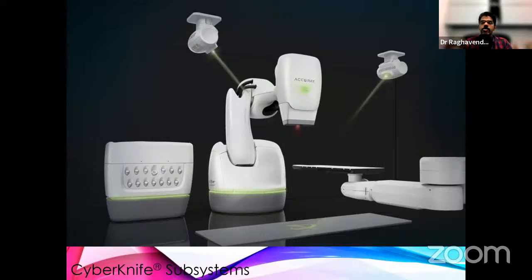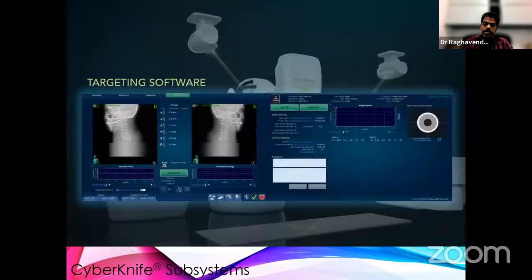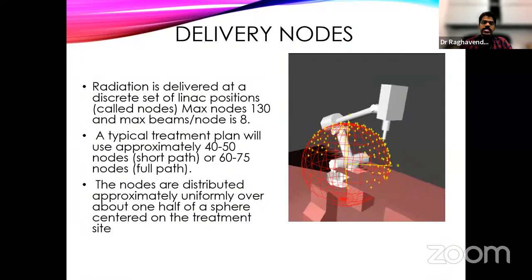The system keeps on acquiring the images and looking where the patient is, and whenever there is a movement or any adjustment has to be done, that correction has to go back to the robot arms. Before going to the next position, the robot corrects it and then goes to the next position. So that is the advantage of online imaging, without stopping it. So this is how it is.